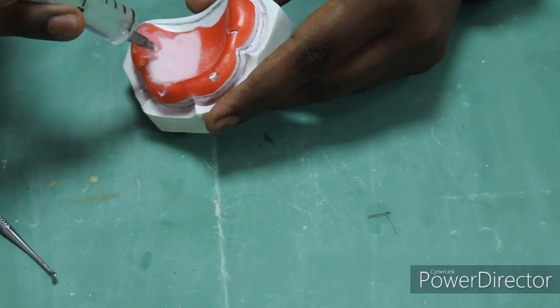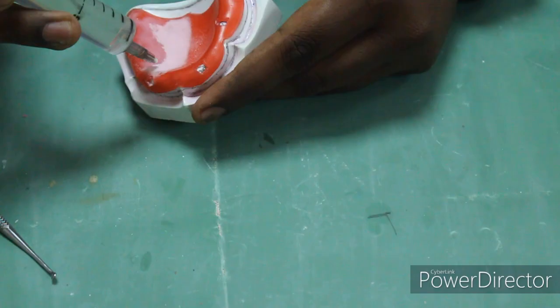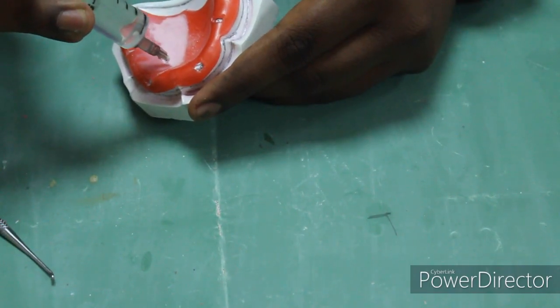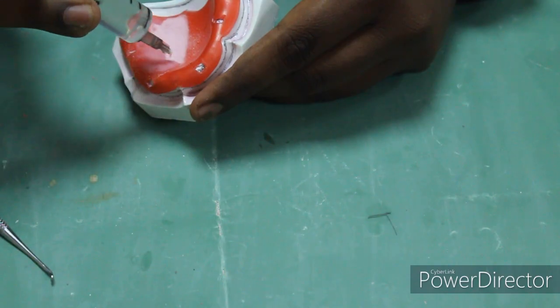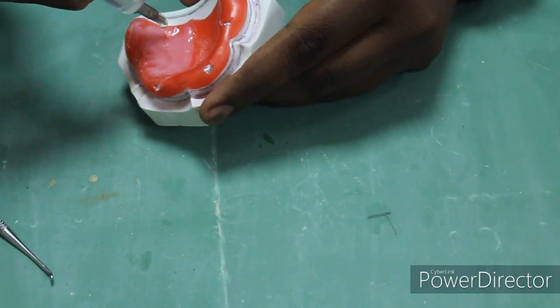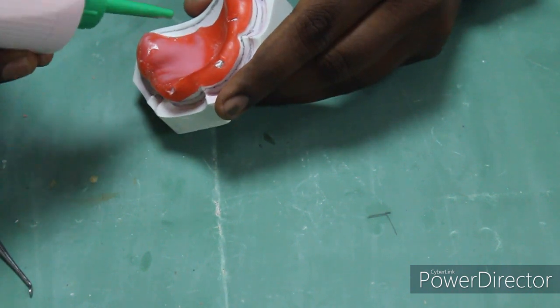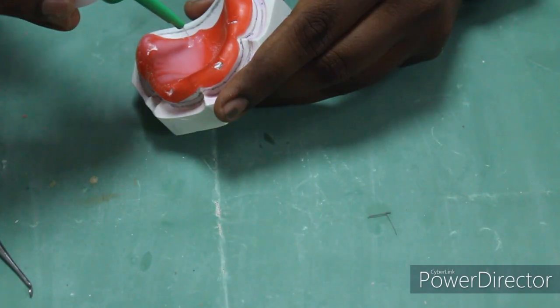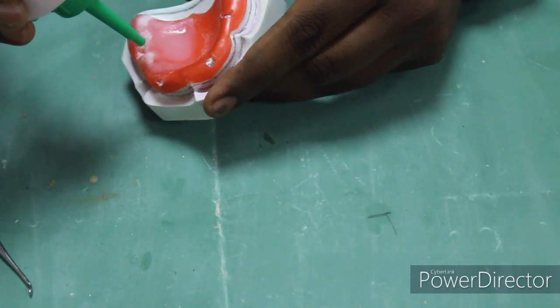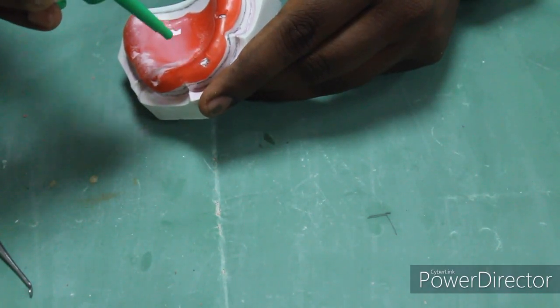So you have to drop the monomer in a controlled manner so that it should not flow away from the surface. So the desired thickness for this special tray will be 2 mm. So once you have dropped the liquid, then you can add the powder side by side.